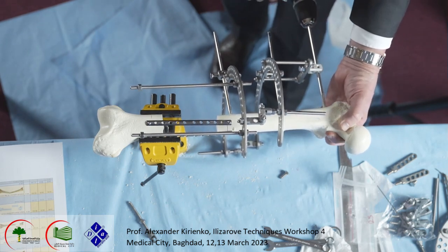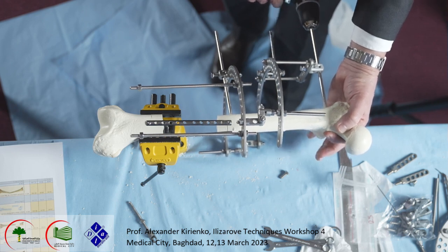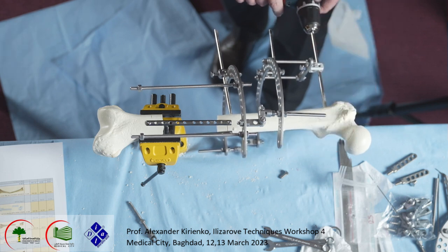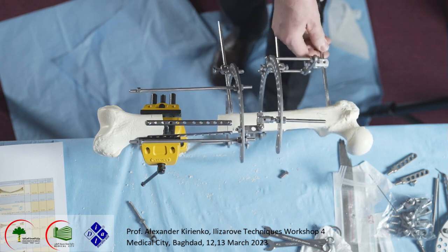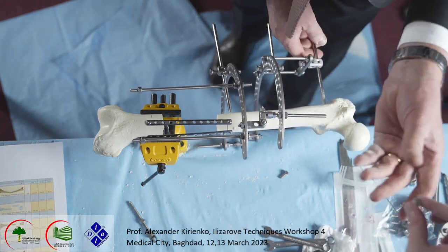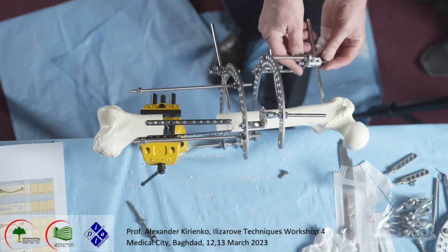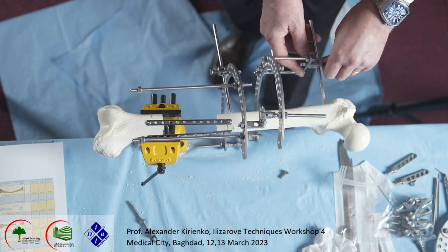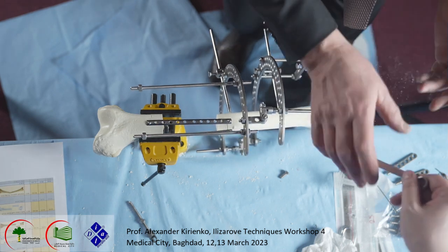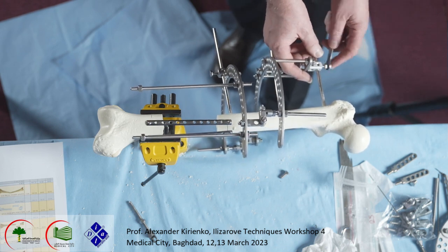Here we use a safe drill in half pin and look in fluoroscopy. Like this. Okay. Like this.